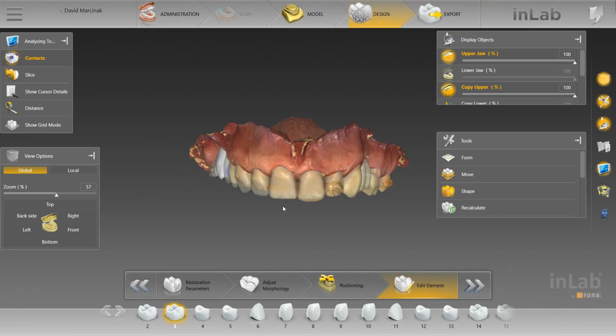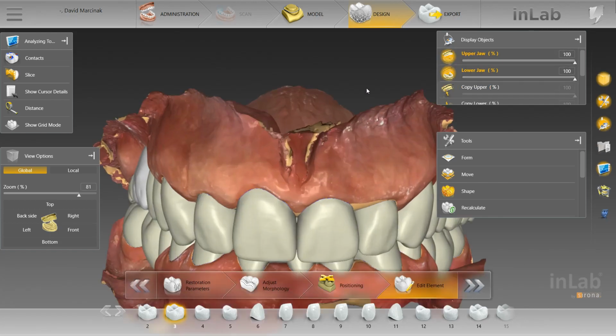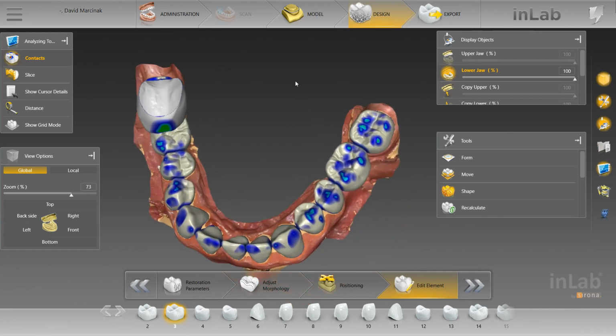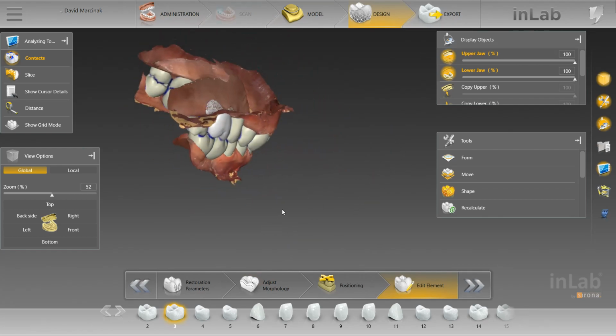You can see what we've done here. It turned out absolutely beautiful. I'll take away this, show you the lower jaw as well. Got a nice occlusal plane. This is going to be a total success once it goes into the mouth. We've got nice occlusion all the way across. Very, very thrilled with the results of this.